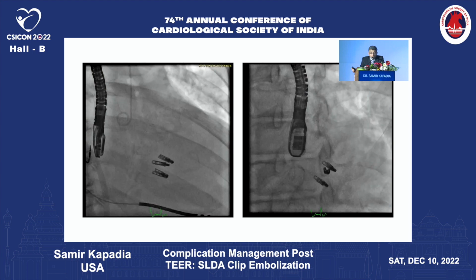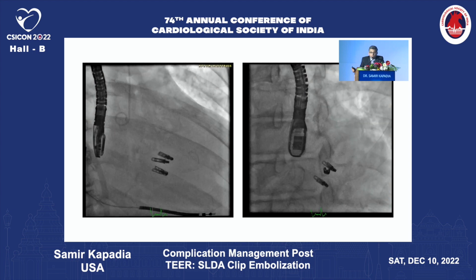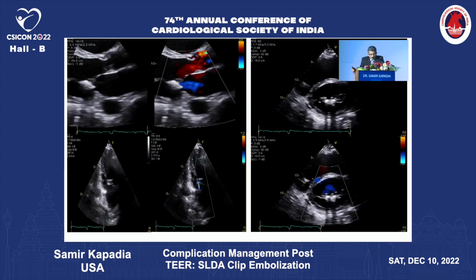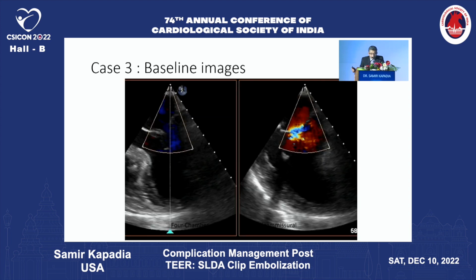And these are small clips. As you can see, these are all NT clips rather than XT clips because the leaflet was torn. And the patient has an excellent outcome. So lesson 2 is stabilize the clip.